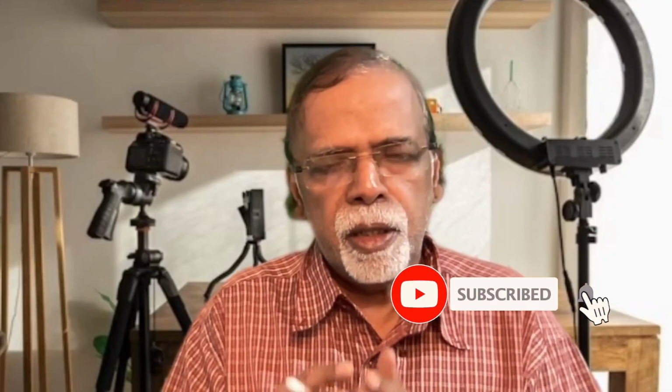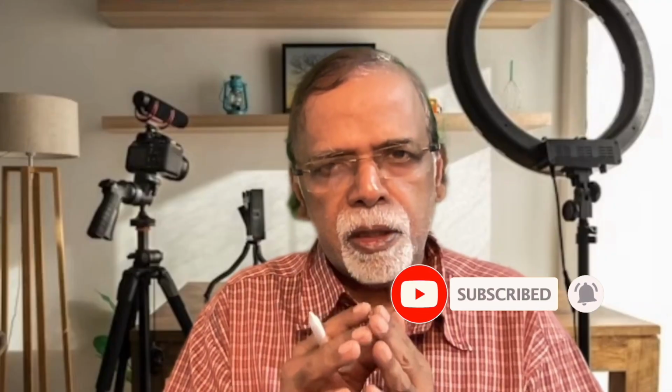Hope you understood. So today we have discussed how to record the brainstem auditory evoked responses. We divided them into early, middle, and late latencies, and the first 10 milliseconds is the most important. The fifth waveform is the most prominent one, and wave one is from the cochlear nerve.